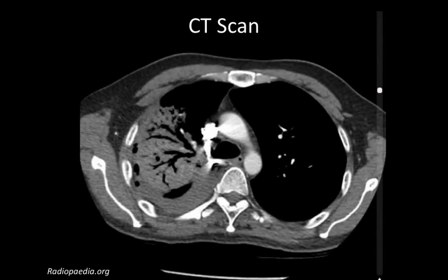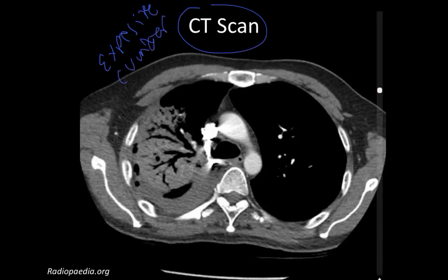Next modality is the CAT scan. CAT scans are expensive, they are cumbersome, they do carry radiation risk, and they do carry a risk that nobody talks about, and it's usually the incidental findings that will require further investigation, that might result in morbidity and even mortality, and it wouldn't have happened if the person didn't get a CAT scan.